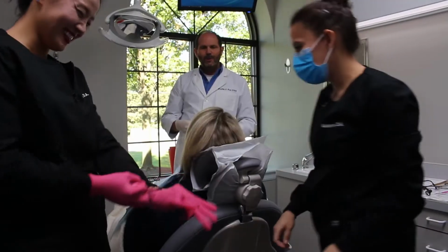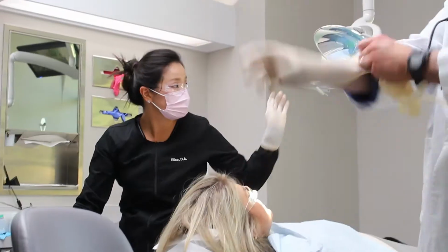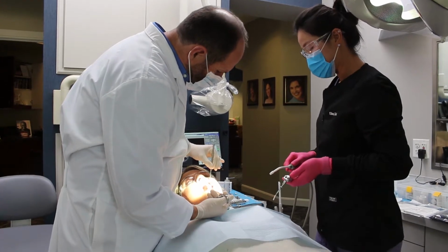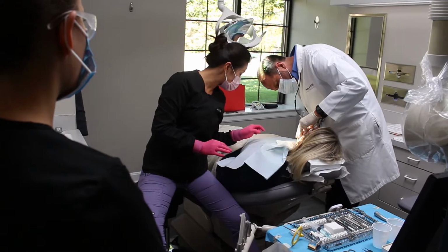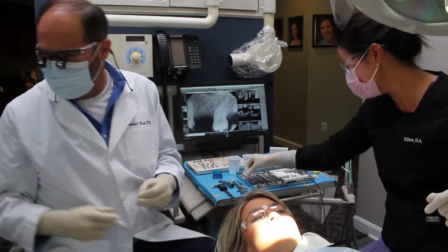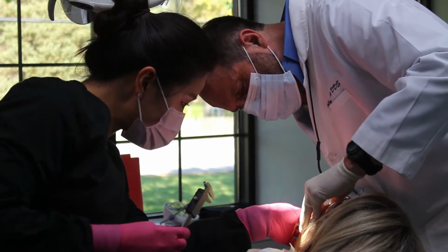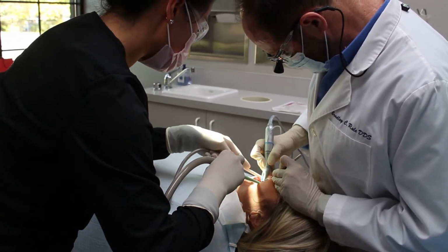Doing a dental implant is a fairly easy procedure. What we need to do after we've determined the size of implant that we're going to place, we go ahead and we numb the patient appropriately. Then we elevate a small flap in the immediate area where we're going to be placing that dental implant. Then we use a series of really small drills with a lot of irrigation. And then we go to the certain depth that we need to create a space sufficiently large that we can place the dental implant in.